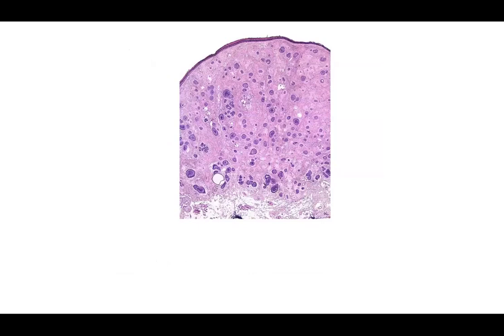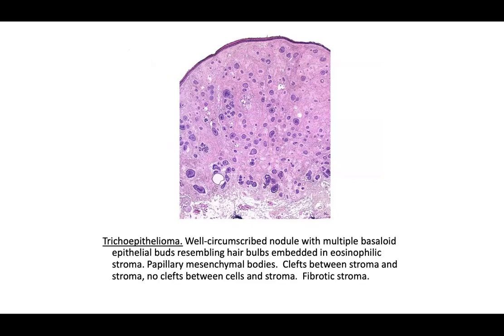What's your differential diagnosis? This is a trichoepithelioma. So if you were thinking a micronodular basal cell from this power, don't blame yourself. It's hard to tell at this power what you're looking at, but even from this power, you can see that it's a basaloid tumor without a lot of retraction around the tumor proper. So you just have these really well-formed basaloid islands. You've got some areas of potential calcification. It's pretty well organized. The cells are bland if you go on high power.